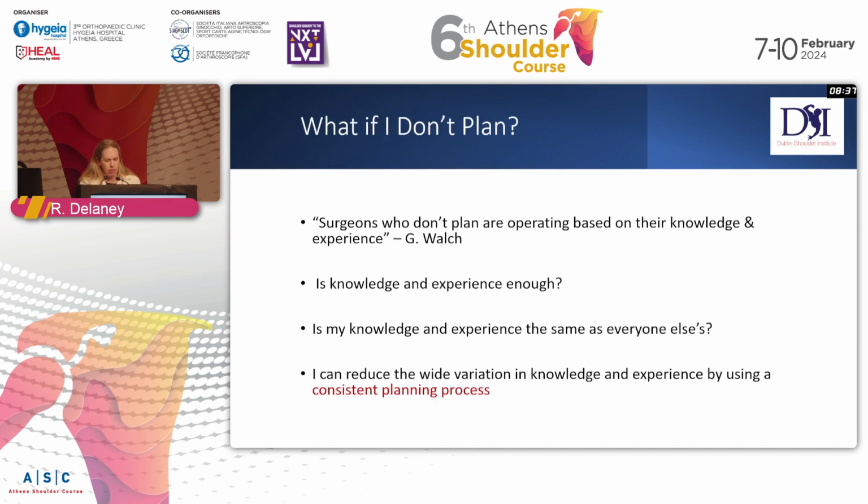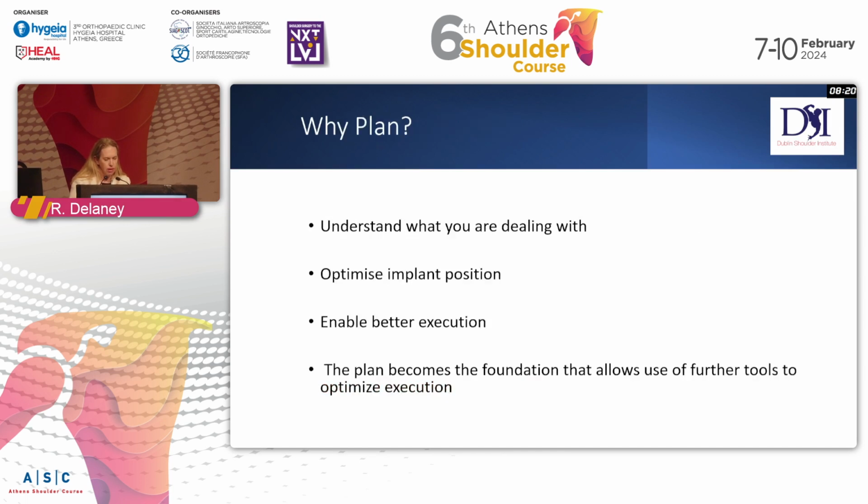Gilles Walch was asked, well, how about surgeons who don't want a 3D plan? You know, operating still based then on knowledge and experience, but is my knowledge and experience the same as everybody else's? We have wide variation, and so I think the planning software can help eliminate the variation by having a consistent process in that. So why plan?